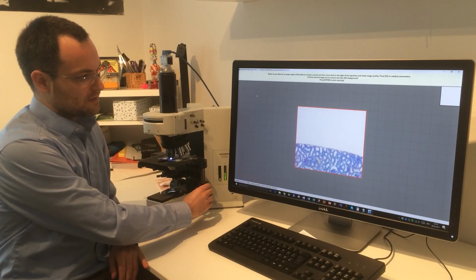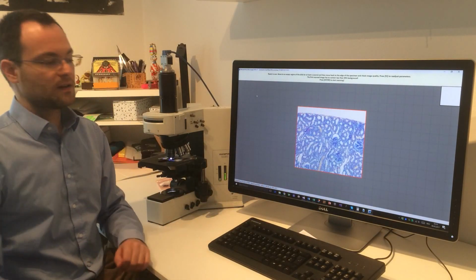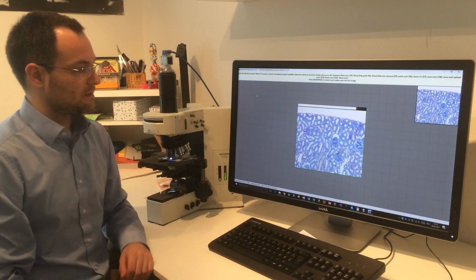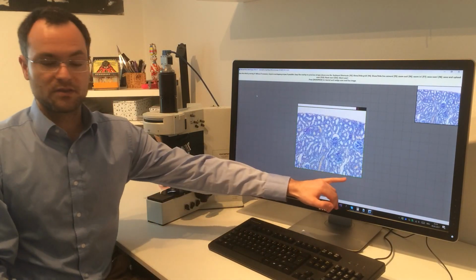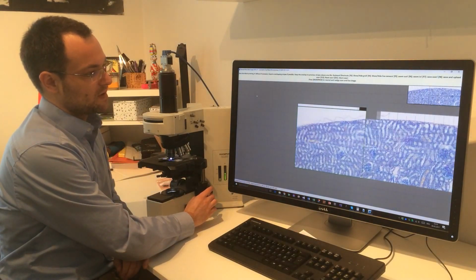You move out of this sample and move back. Now the sample looks like it should look, and the next step is to press enter to start scanning. Now the border is turning green and you can scan the slide by moving it.